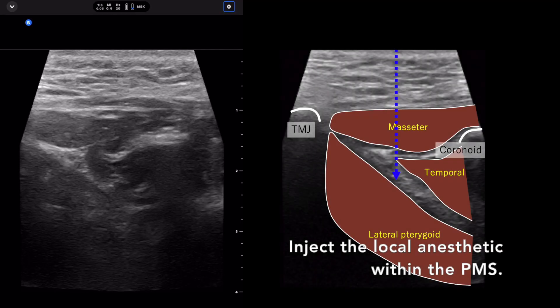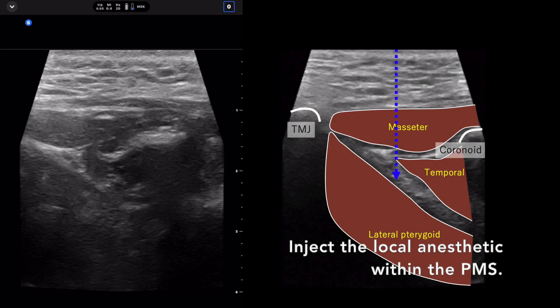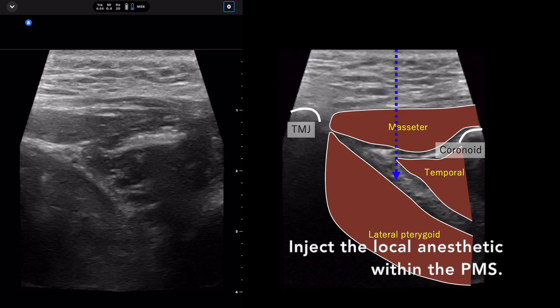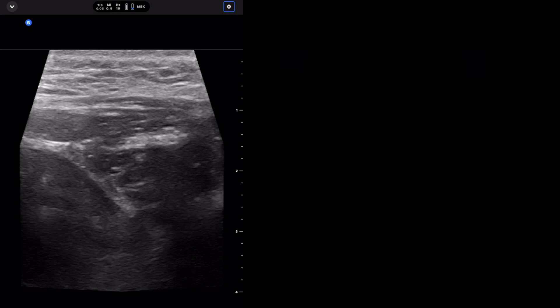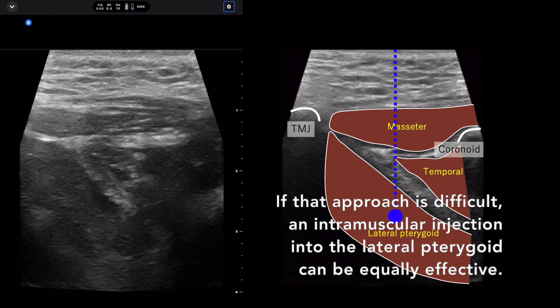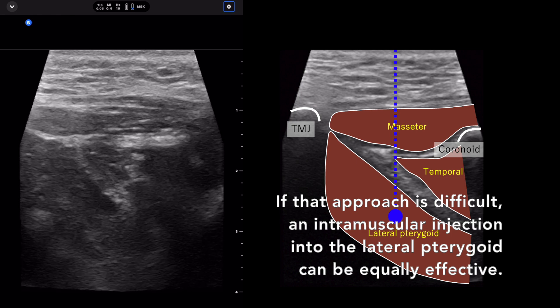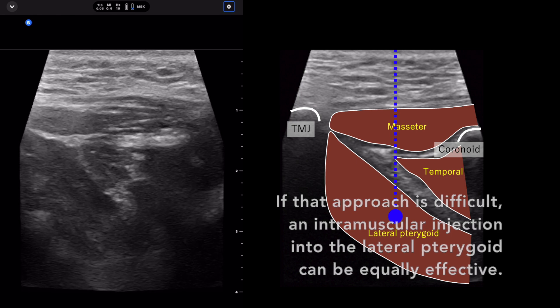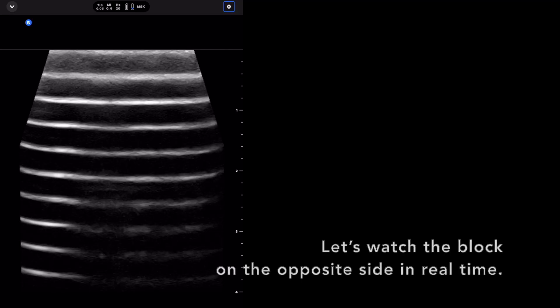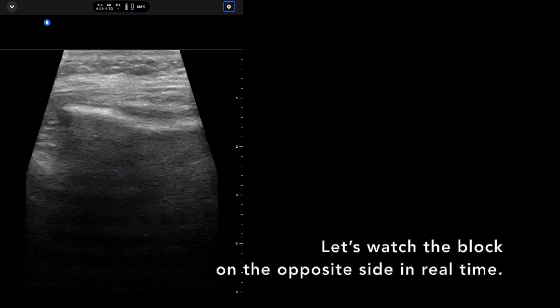Inject the local anesthetic within the pterygomandibular space. If that approach is difficult, an intramuscular injection into the lateral pterygoid muscle can be equally effective. Let's watch the block on the opposite side in real time.